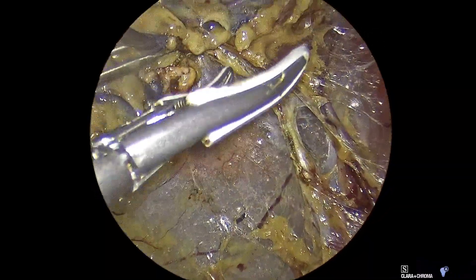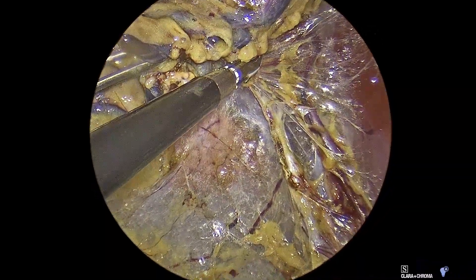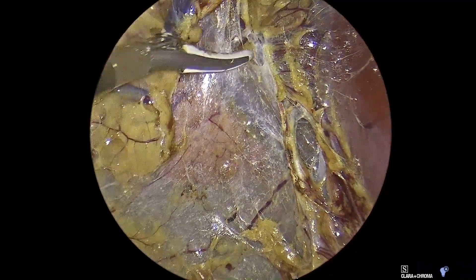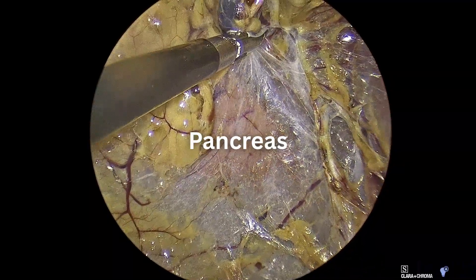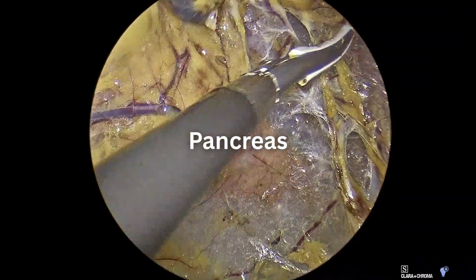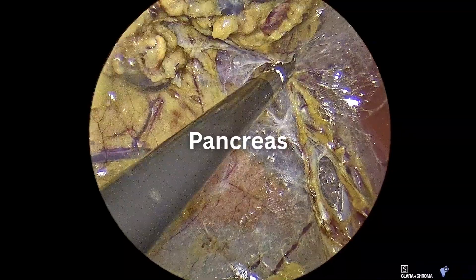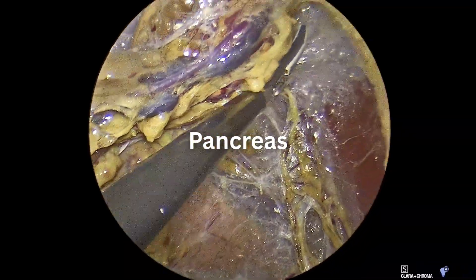Deep to the structure, the salmon-colored tissue is the tail of the pancreas, which is preserved.